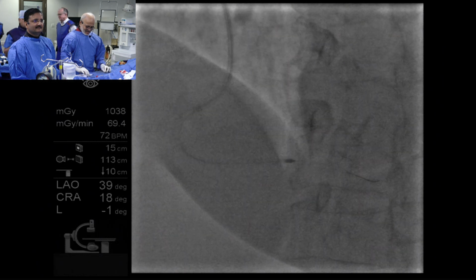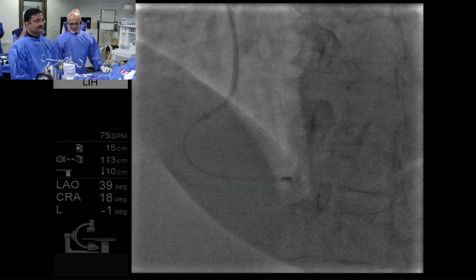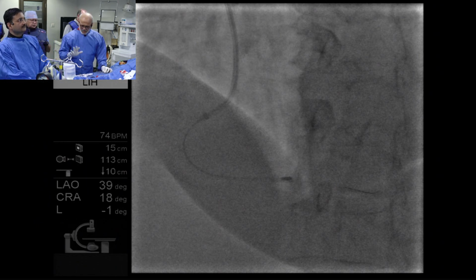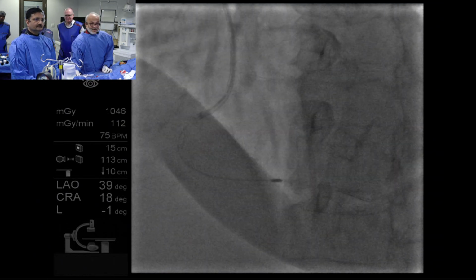Just, the Japanese position paper says that they do the final run at a much lower speed, like 130, because of judder and a bigger sweep. Do you ever do that, or do you stick with one speed? No, I don't think so. We have the same experience working. So I will adhere to this technique, but it can be good because the Japanese are doing so much work.